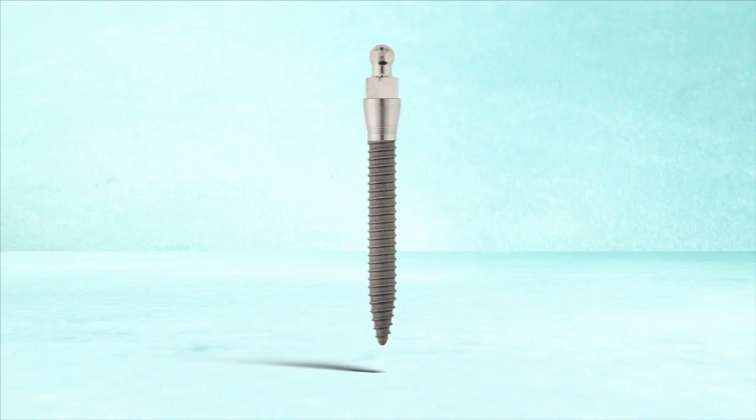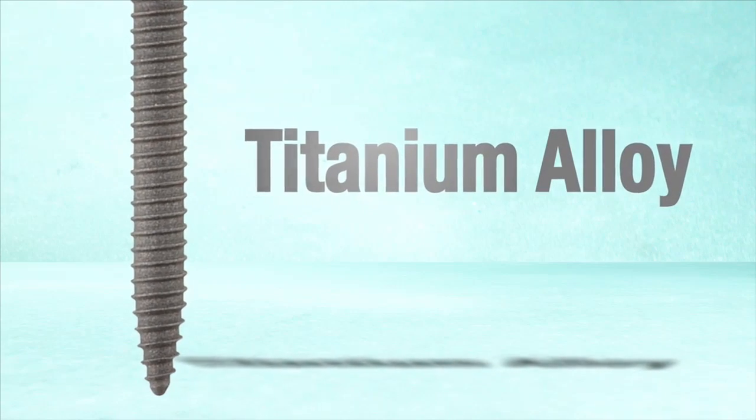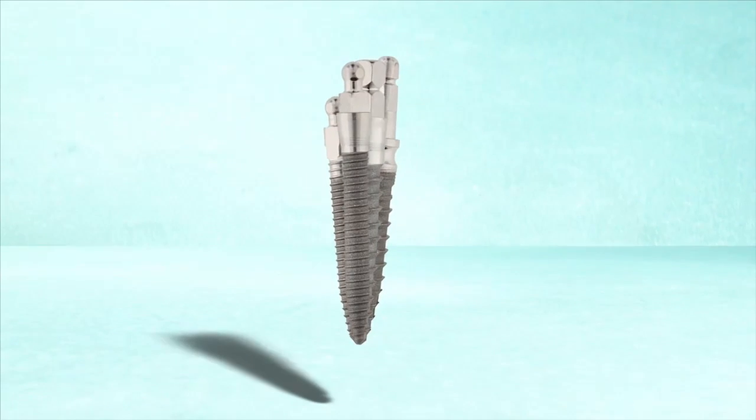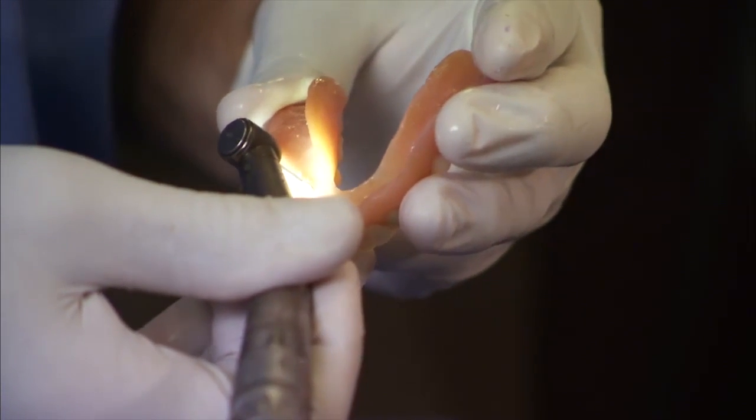MDI Mini Implants are made from a titanium alloy threaded post for implantation into the bone. A range of transgingival collars and abutment heads with a replaceable securing O-ring are available to create a customized fit for dentures and bridges.